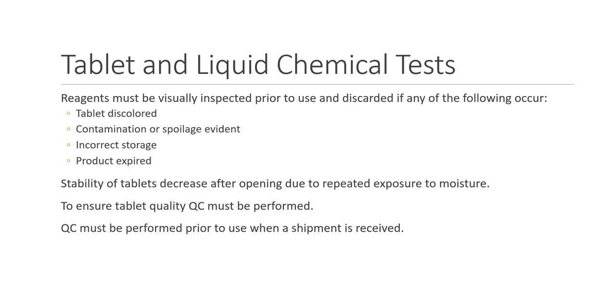Stability of tablets decreases after opening due to repeated exposure to moisture. To ensure tablet quality, quality control must be performed prior to use when a shipment is received.